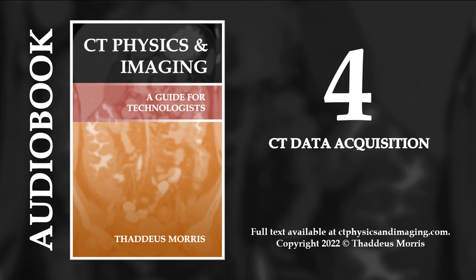As evidenced by the previous case study, all the variables of data acquisition are interconnected in various ways. Changing one often results in changes to the others. When the technologist makes a change, he or she should do so with an understanding of how that change might influence the scan speed, spatial resolution, image noise, and patient dose. Here's one more case study to test and stretch your knowledge of data acquisition factors.